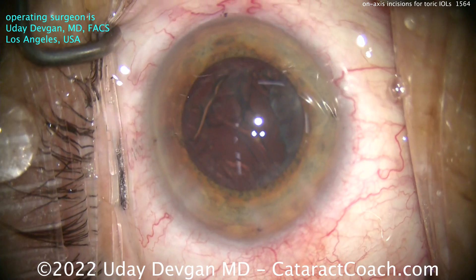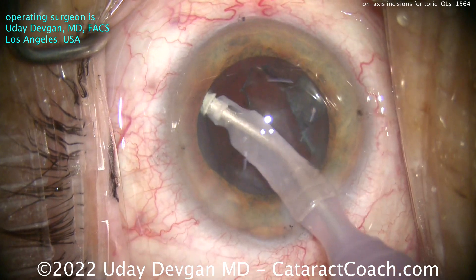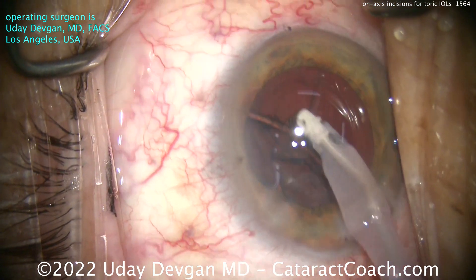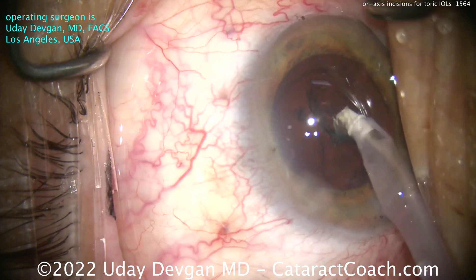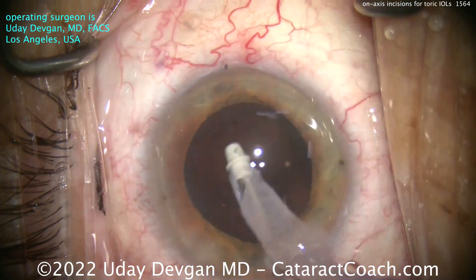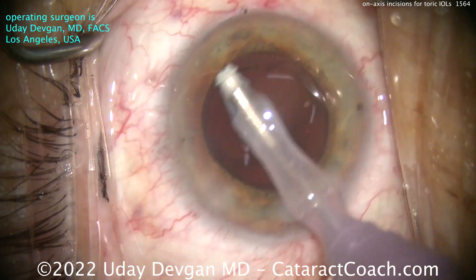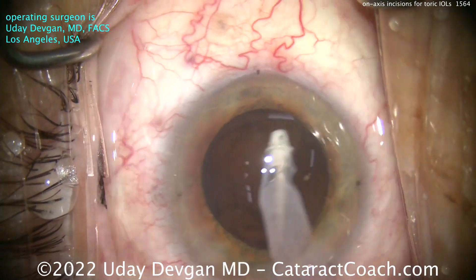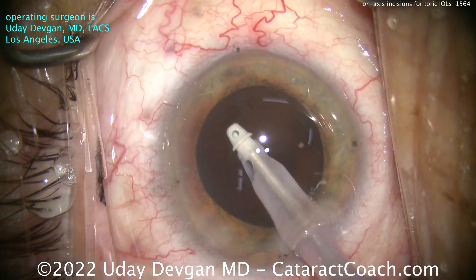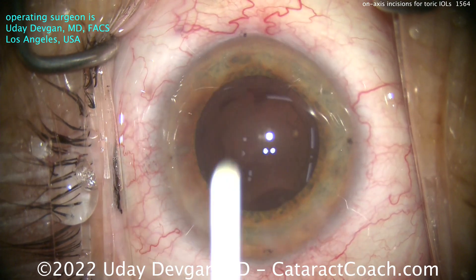So in order to have a more accurate result from surgery with a toric lens, always make your incision on the steep axis if you can. That's going to slightly decrease or help treat your astigmatism and, more importantly, will not change its direction — so your calculations ahead of time will be far more accurate. Alternatively, you can make your incision on the flat axis, 90 degrees away from the steep axis, which will slightly increase the astigmatism, but again will not change the direction or the meridian of the astigmatism.